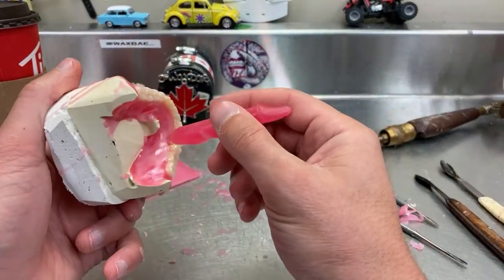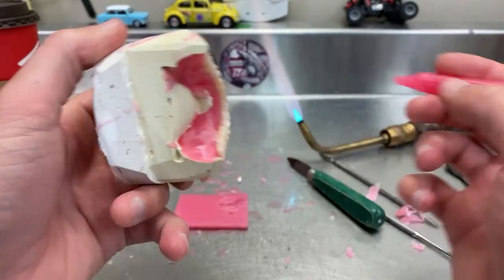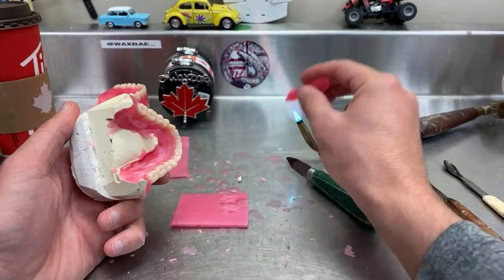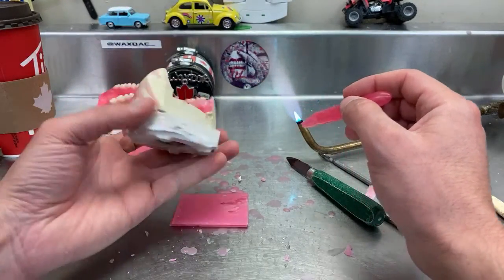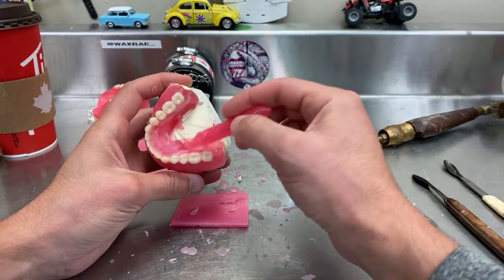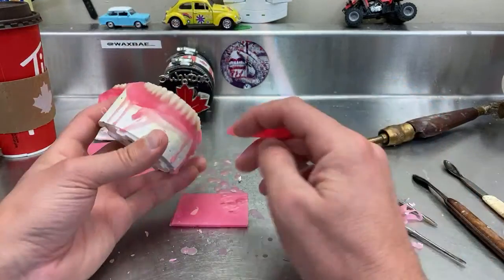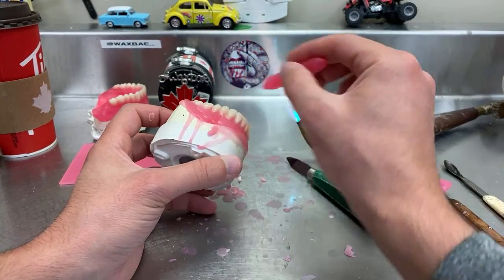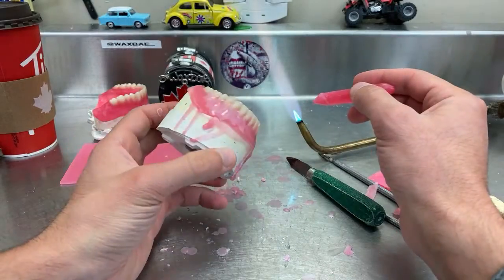Okay, so I noticed there's a little bit of, let's use that. If you look at it that way, you see that the tooth is higher than the wax, and you don't want that kind of look. Same thing, I'm adding to the thin areas. And whichever tooth that I feel is more exposed, these are okay, except that side.